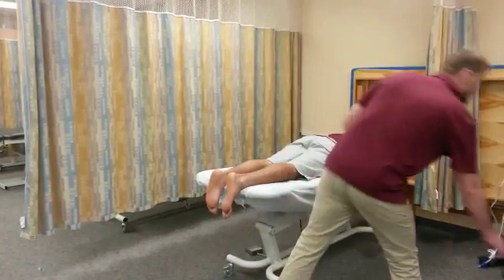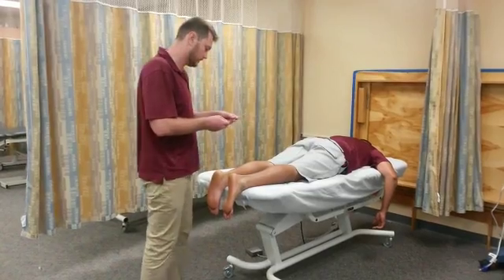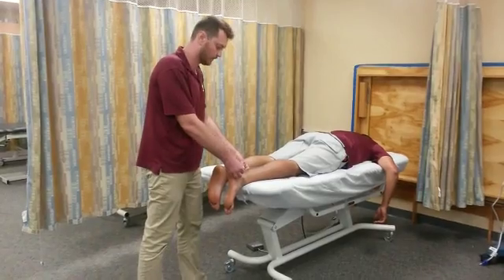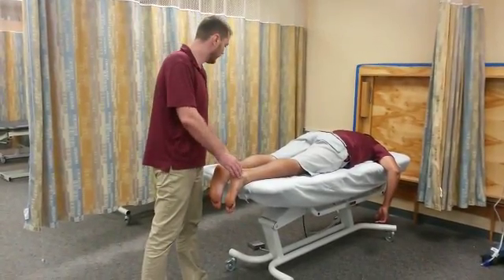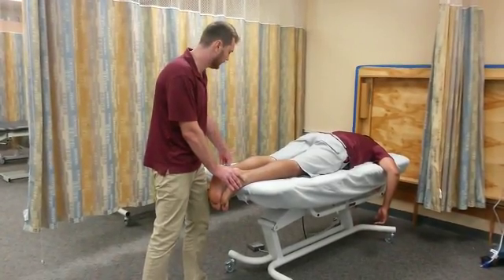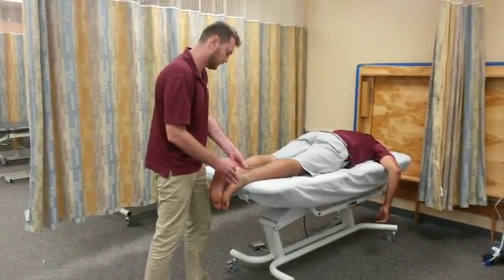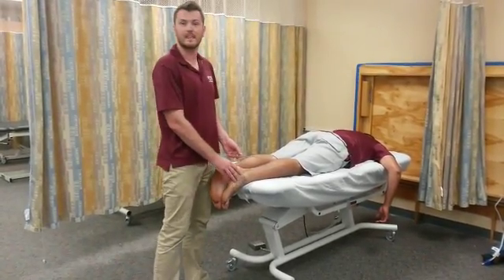Now I'm going to take the goniometer and align it with the anatomical landmarks. We're already recording the starting position, which is zero. Then I'm going to remove the goniometer and perform passive range of motion. Now I'm going to realign the goniometer with the anatomical landmarks and record, which is five degrees. Thank you.